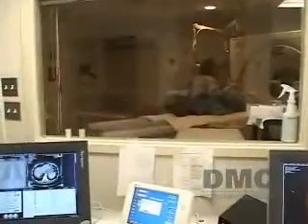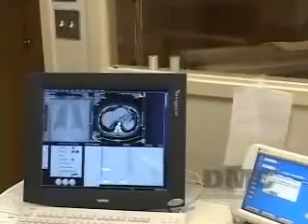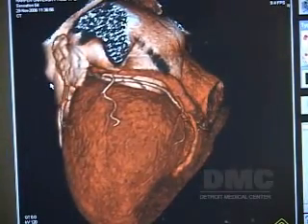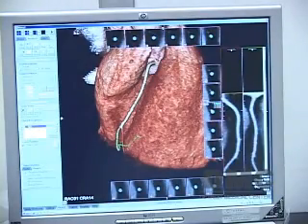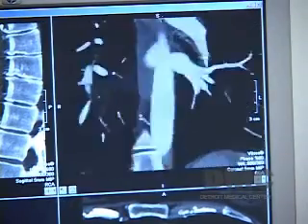When we tell somebody your CT angiogram of the heart is normal, the chances for us to be wrong are 0. Since this coronary CTA, or 64 slice, can provide evidence of early disease, it has proven especially valuable in patients with mild or no symptoms, but who are at risk for coronary artery disease. If you take patients with coronary artery blockages, severe or moderate blockages, only 30% of these patients will ever have a symptom of chest discomfort or pain. In 60 to 70%, the first symptom is sudden cardiac death or a heart attack.